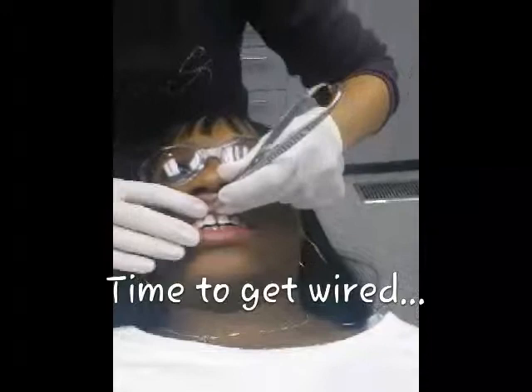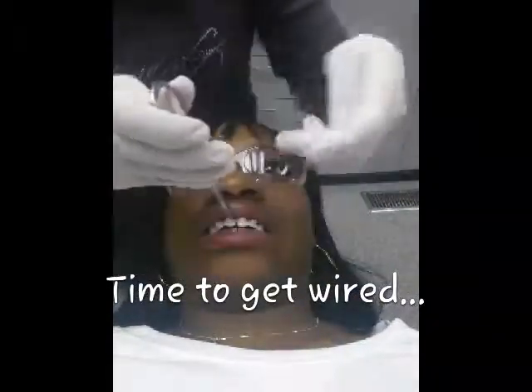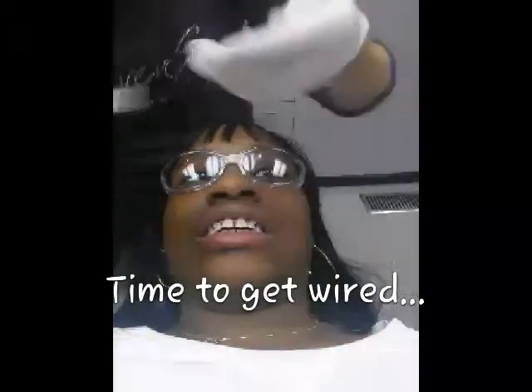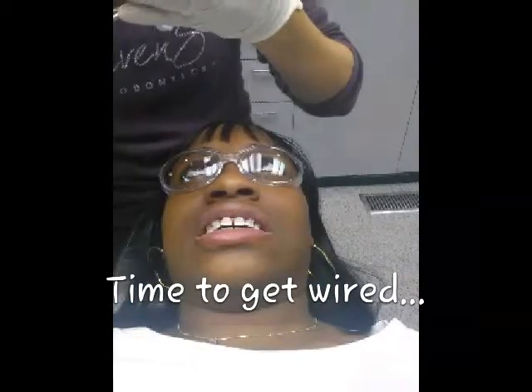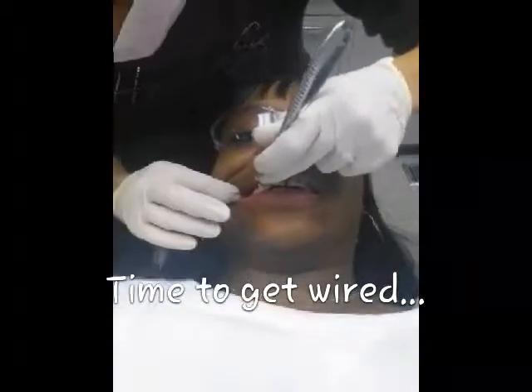And then you'll notice that she takes some type of snipping tool at the end, and she snips the wire, because of course the wire can sometimes be too long, and she didn't want it poking my cheek, so she snipped it in the back.